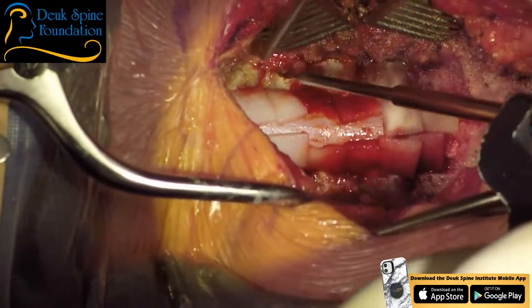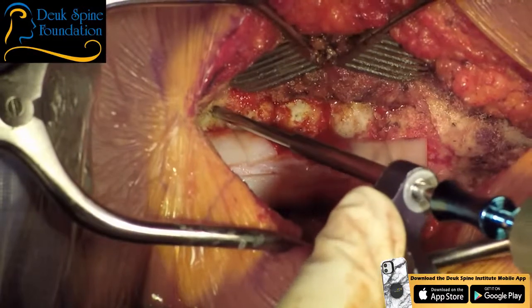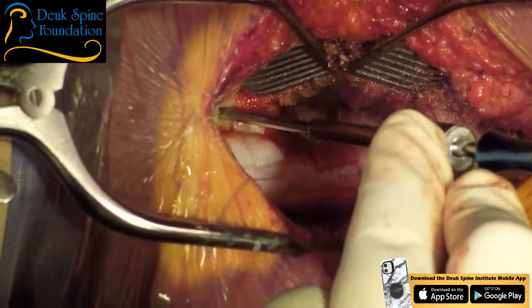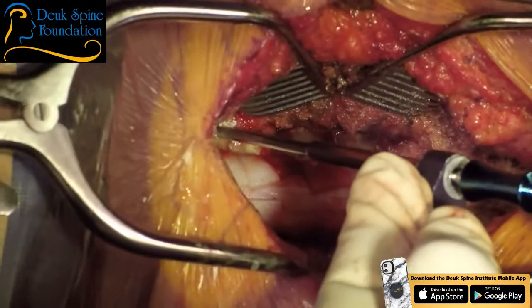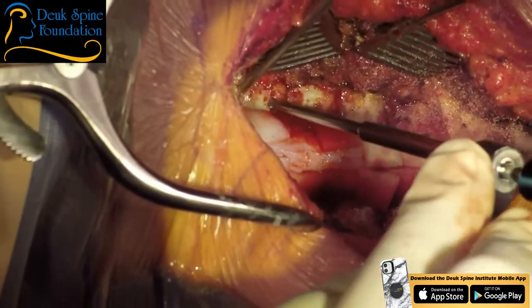All right, so there's C3. I'm going to start with C3. And I'm angling 20 degrees out and 20 degrees up. And she's got really hard bone. So 20 out, 20 up. Okay. That's one down. That's C3.